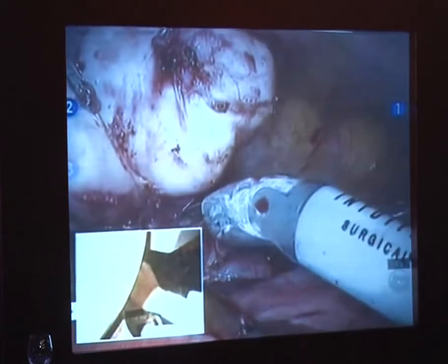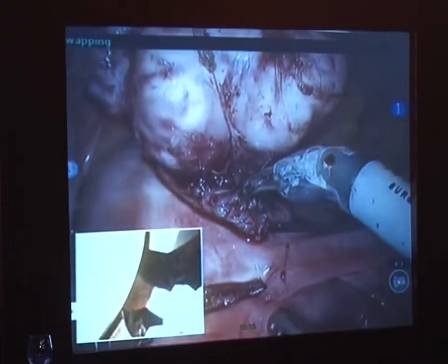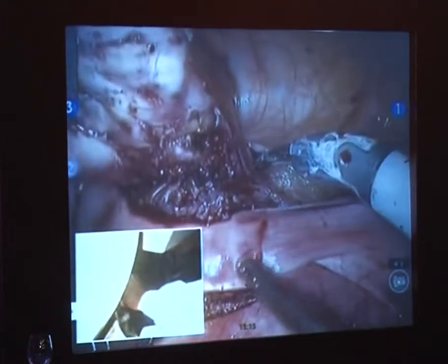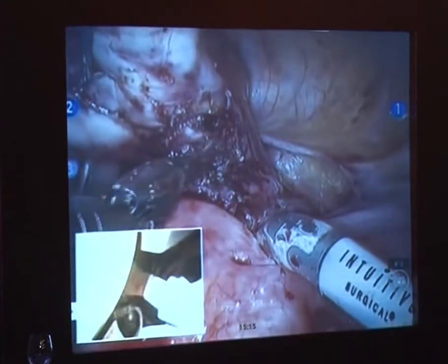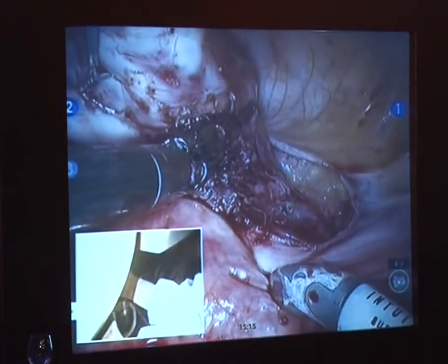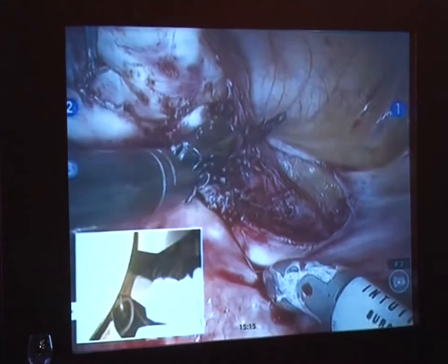There's just some attachments along the myoma here. Do you think at all in any terms of strategy of putting thrombin in the defect because of all of the small vessels and veins that may be in there? You could if you were concerned that you didn't get hemostatic enough. I think that when we're done here, we'll get a good idea of what it's going to look like, and then we can decide whether or not you would benefit from that.